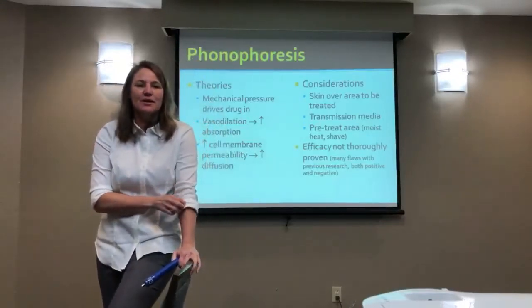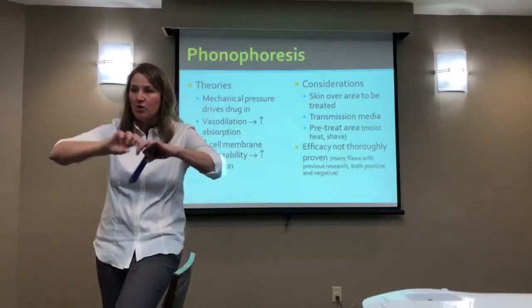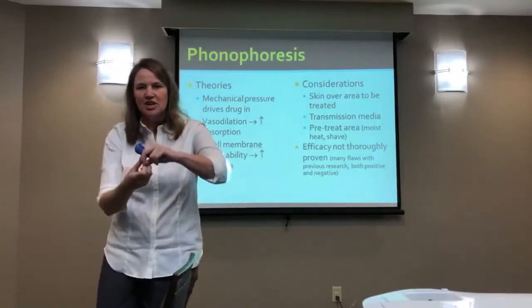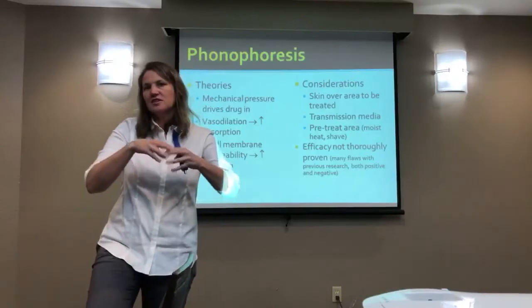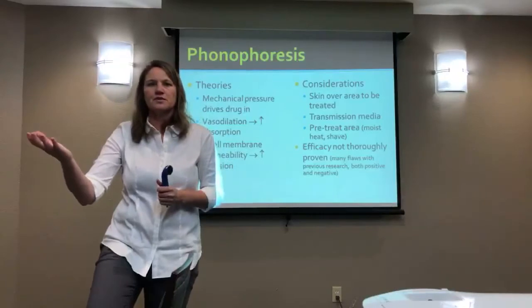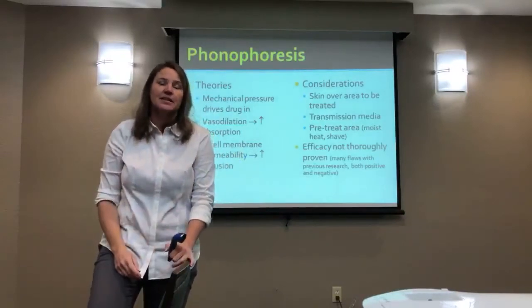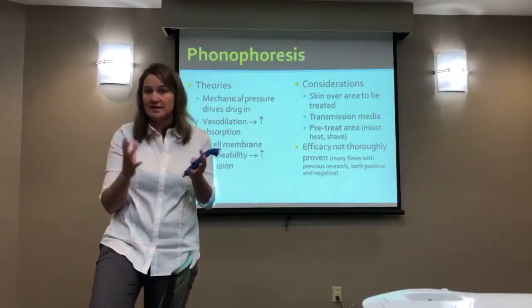Okay, so think about the transmission media as well. So you described people mixing Biofreeze with gel and using it. I do think there's people out there being their own chemist, putting a drug into a gel. But the reality is, if you were going to do that, you just changed the makeup of the product anyway. If you had a 4% dexamethasone product and you mixed it with a bunch of gel, you just diluted it tremendously. So I think that idea is a potentially harmful one. If you're doing that, how is there any control in what exactly you ended up with?